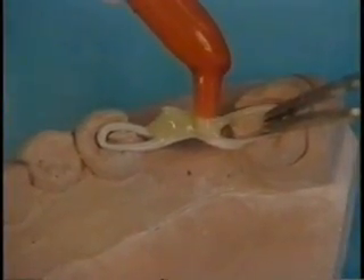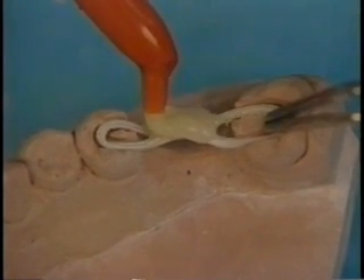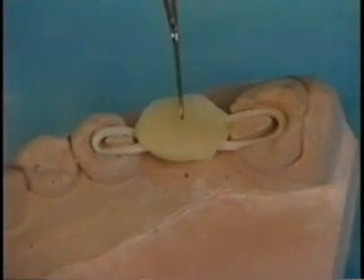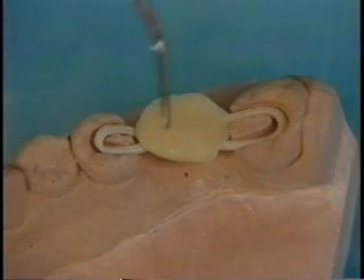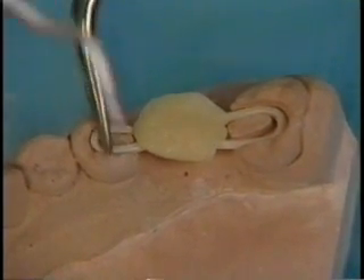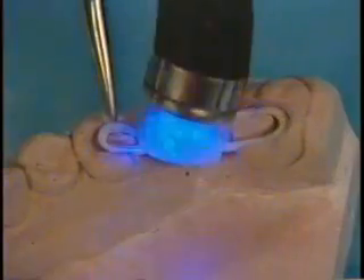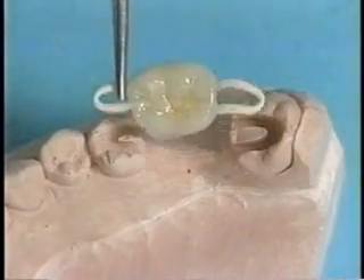The pontics may be constructed using any of the available posterior hybrid composite resins. Incrementally build and sculpt the composite resin, curing each layer until proper anatomical contours have been achieved. The flexible glassband attachments, which extend beyond the pontics, remain untreated up to this point. The highly aesthetic bridge with flexible attachments is now ready for clinical placement.